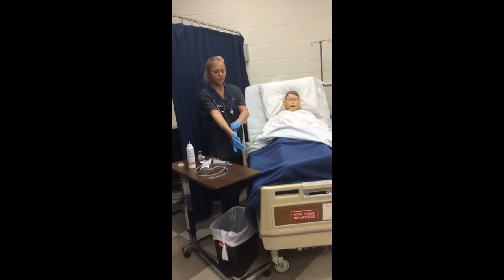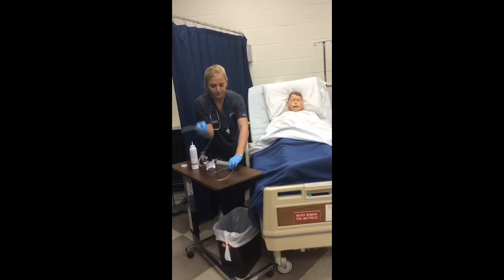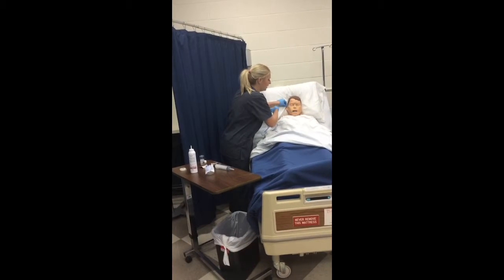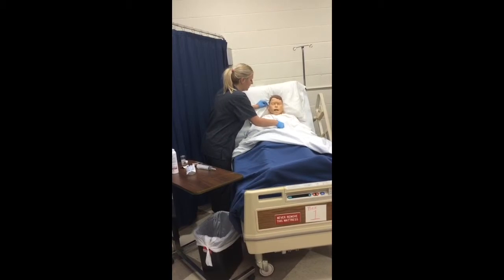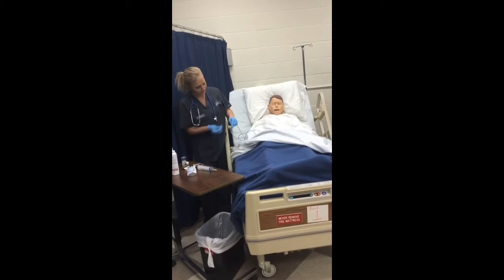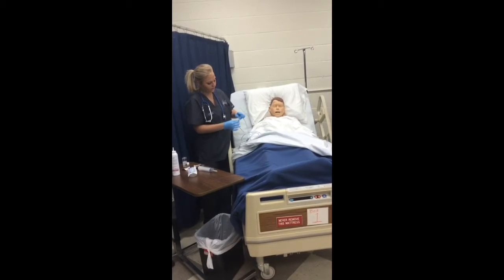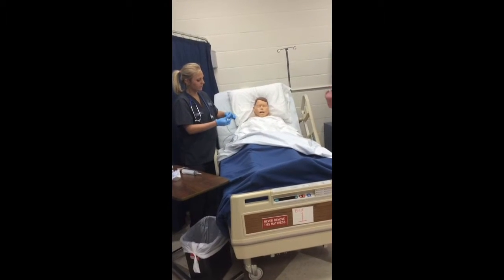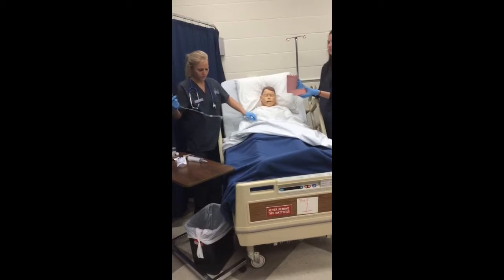Alright, first thing I'm going to do is measure my tubing. I'm going to measure from the patient's nose to the earlobe, and the earlobe to the xiphoid process. At this point, I'm going to place a piece of tape to mark how far we are going to insert the tube. I have my assistant ready with the water bottle.